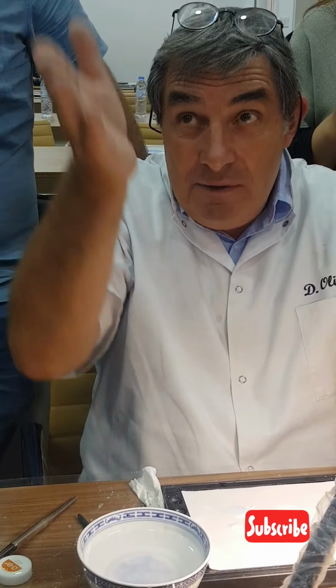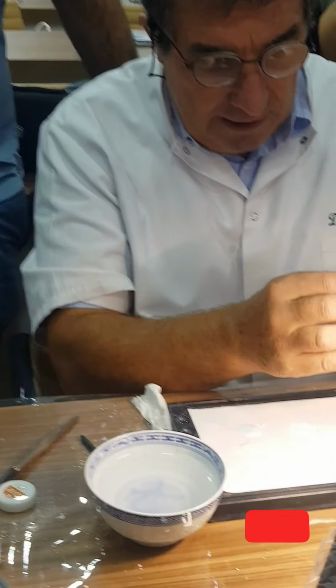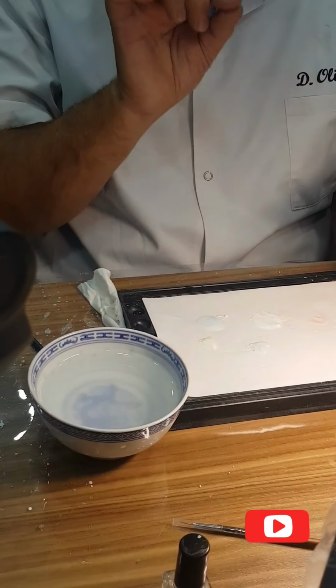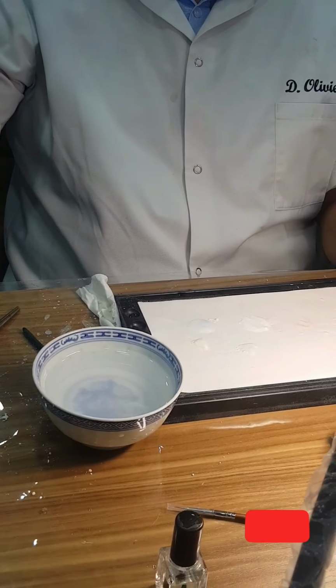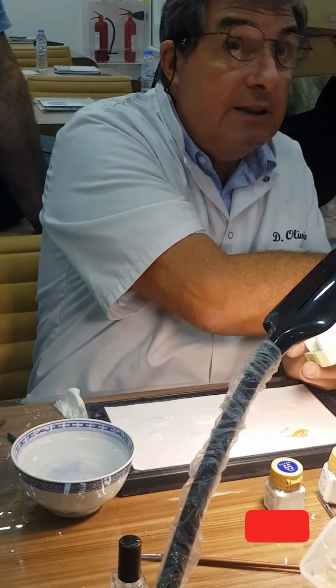If you start to give very angular shapes, you have a result. You change everything inside. It's very, very important. Look, my crown, at the moment, has no beautiful fissure, nothing. Don't be afraid. The fissure, I will do it, but after condensation.